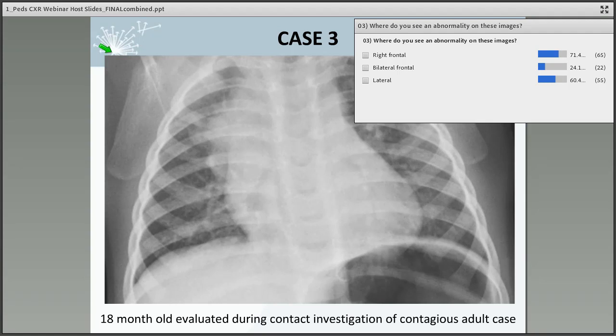So it looks like a lot of people are answering. So I'm going to ask Dr. Wu to teach us about the findings on these films. Great. Okay. Thank you, Anne.